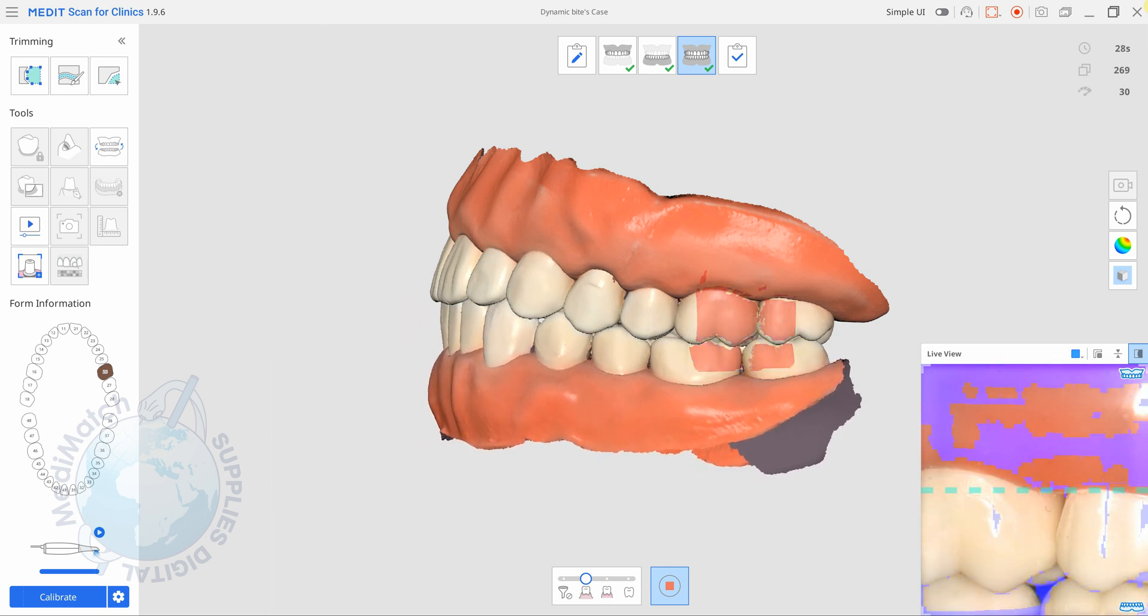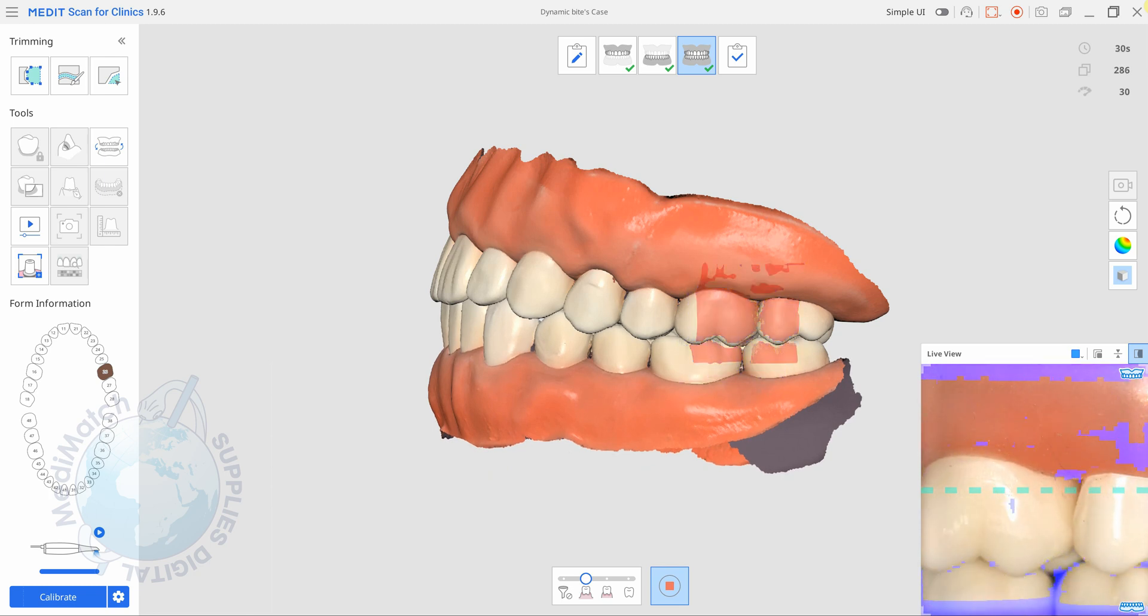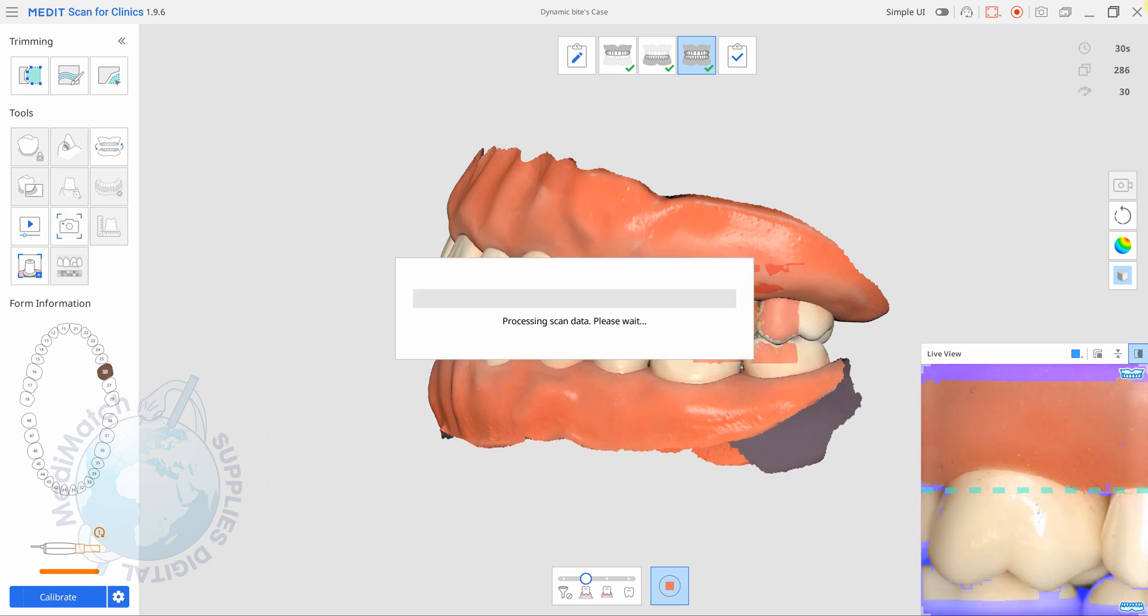I'm going to bring them back together and I'll tap the scan button again and we are now going to record that movement and it will be saved with the case data. It'll take a few seconds to process.